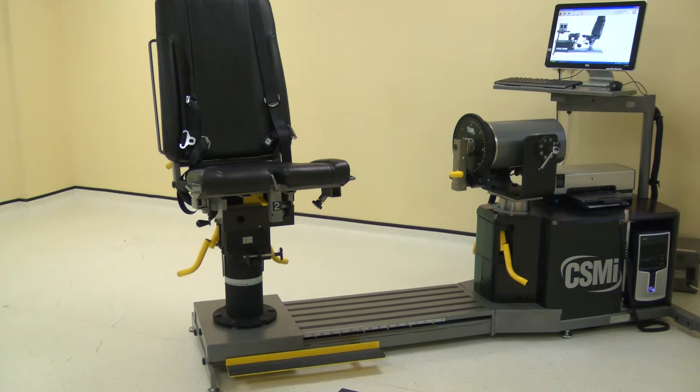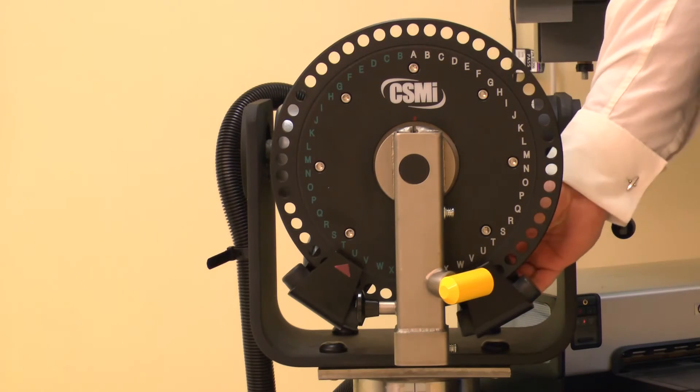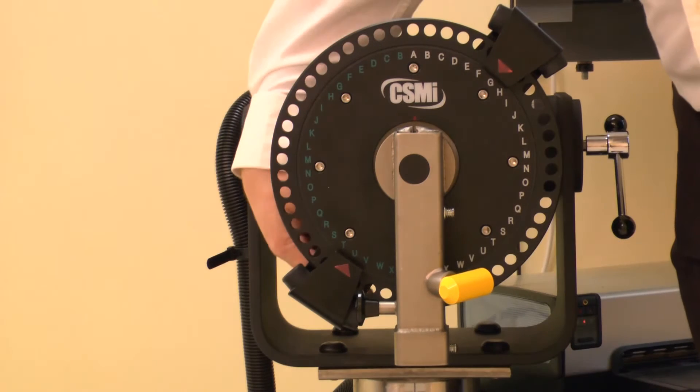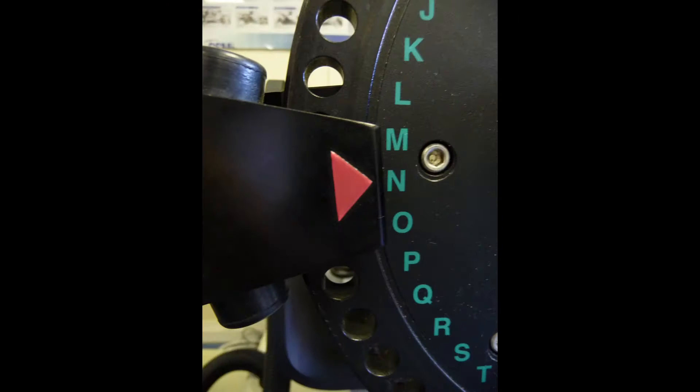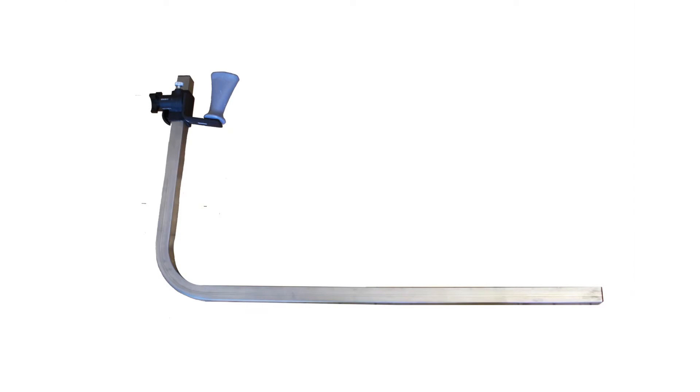To position the machine, first ensure all of the adapters and stabilizers are removed. Move the first dynamometer stop to position Y on the wide scale. Now move the second stop to position N on the green scale. Now collect the adapters and stabilizers for this position.